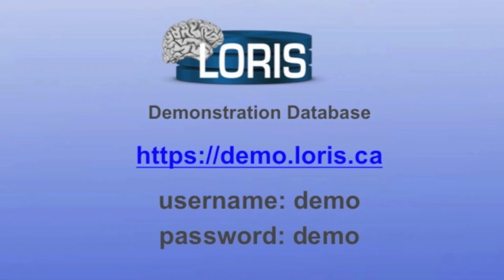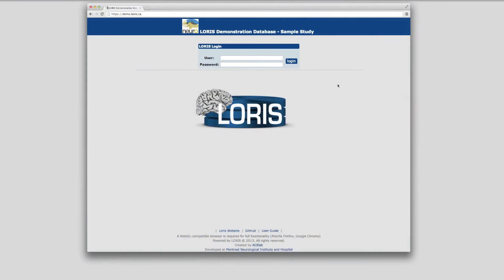Please visit our demonstration database at https://demo.loris.ca, and log in with the username demo and password demo — one word, all lower case. Please note that LORIS is designed to work best with a platform-independent browser such as Chrome.